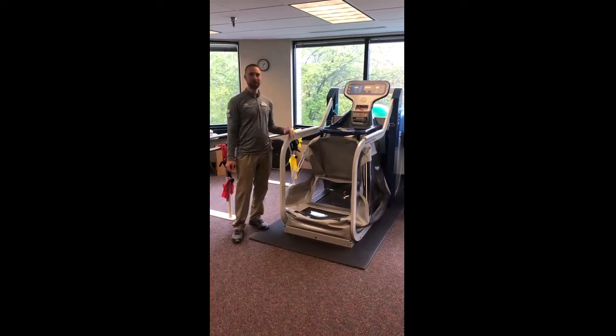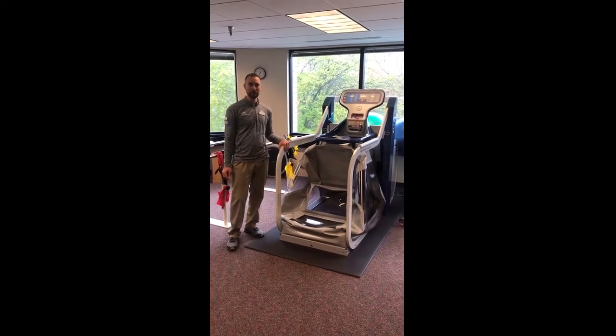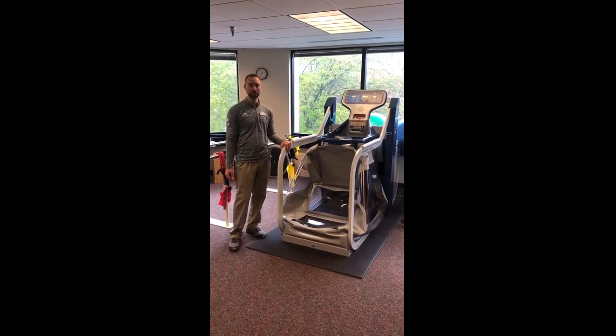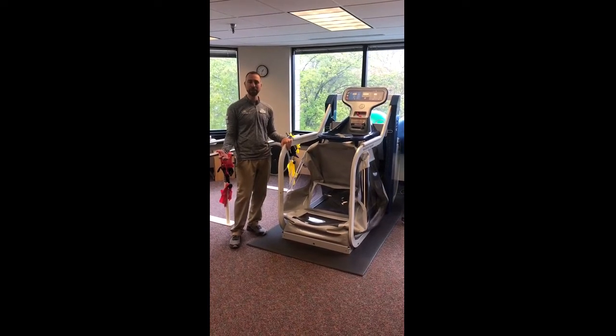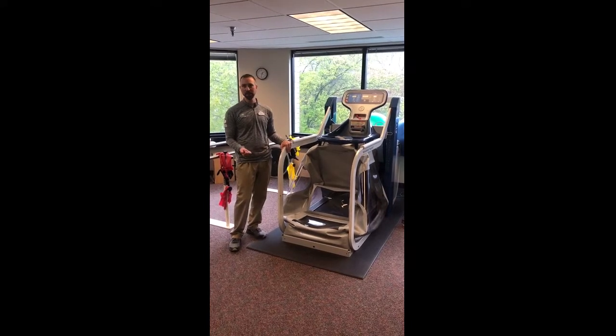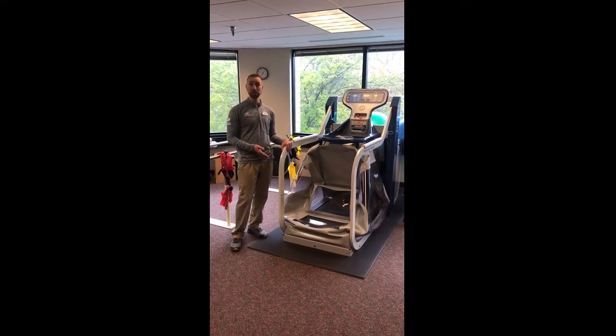The Alter-G was actually designed by NASA — it was designed for astronauts to re-acclimate them when they came back from outer space. When they're in space in an anti-gravity field, what they were finding was that their astronauts would come back with things like muscle weakness, and they were very injury prone.